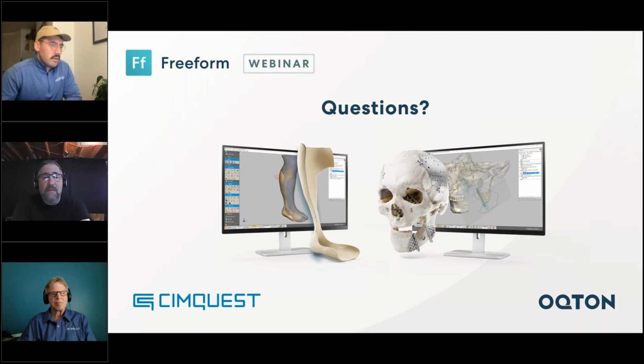Absolutely. Freeform's DICOM import is somewhat limited, especially compared to other tools commercially available, including D2P, but we can view the slice data, we can make selections, we can do some very basic geometry extraction, but it really was not designed to replace a dedicated medical DICOM tool.